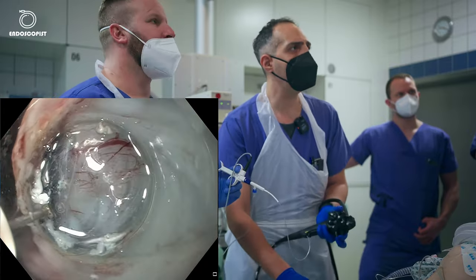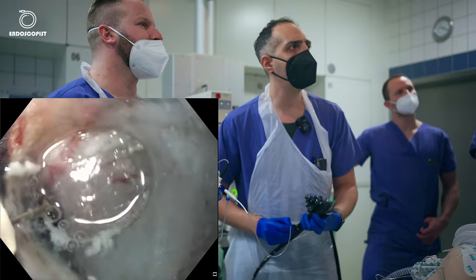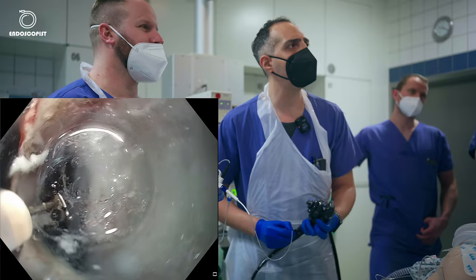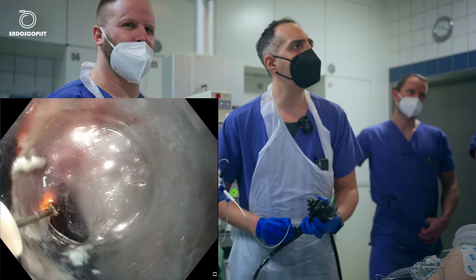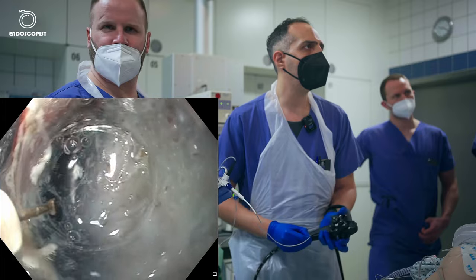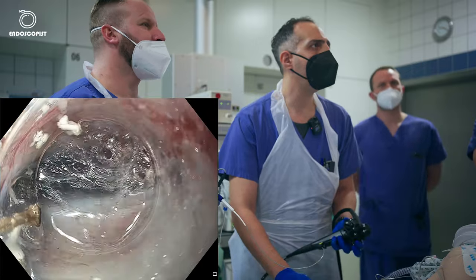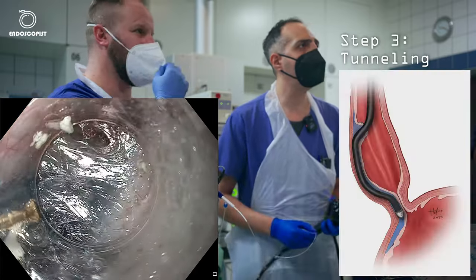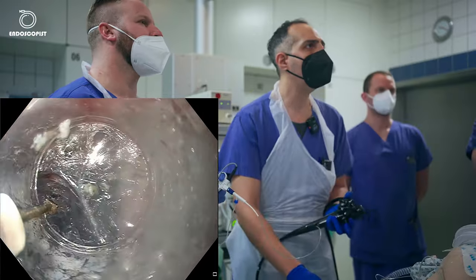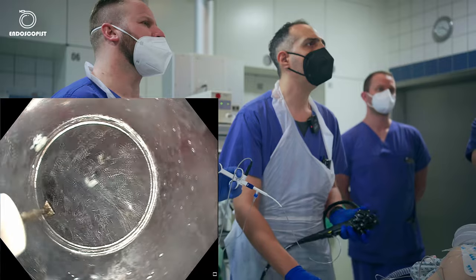So now I'm pushing with the cap. I use the physical pressure. As I said, very important here that the muscle layer will stay intact. Take your time at this step. Now we are inside the tunnel. So I'll start to inject again. And I will use the spray coagulation to go in the tunnel.